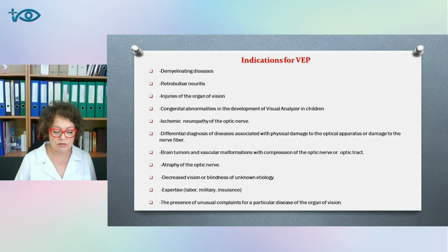Epilepsy is characterized by fusion of several components into higher amplitude and longer lasting complexes with an increase in latent periods. The increase in VEP amplitude in epilepsy can be interpreted as a manifestation of a general tendency of the hypersynchronization of neurons' activity and of the facilitation of afferent impulse conduction.